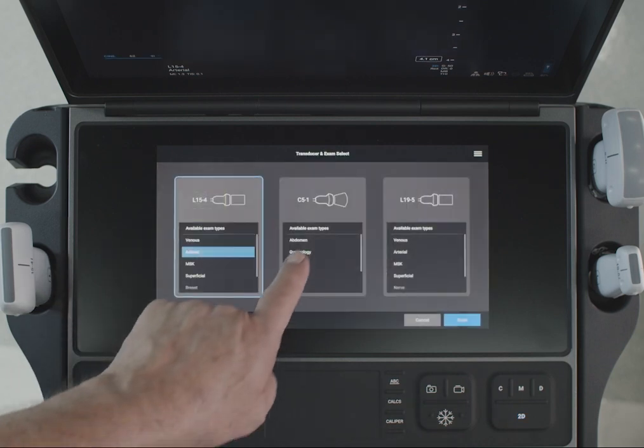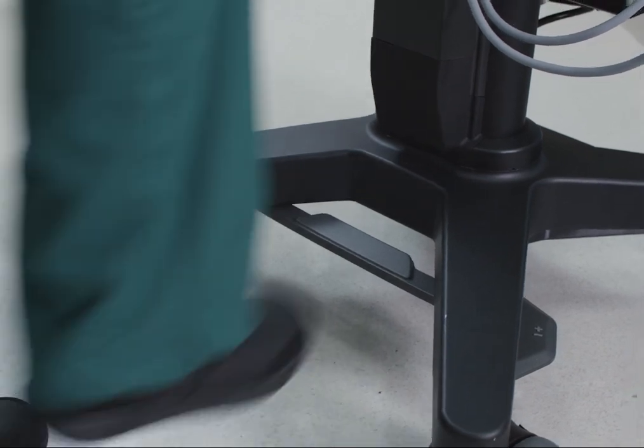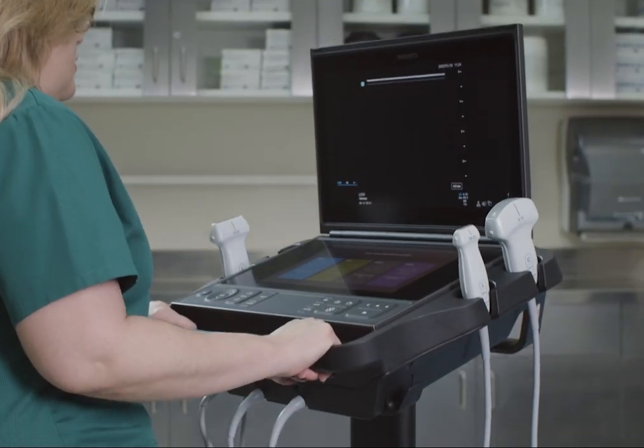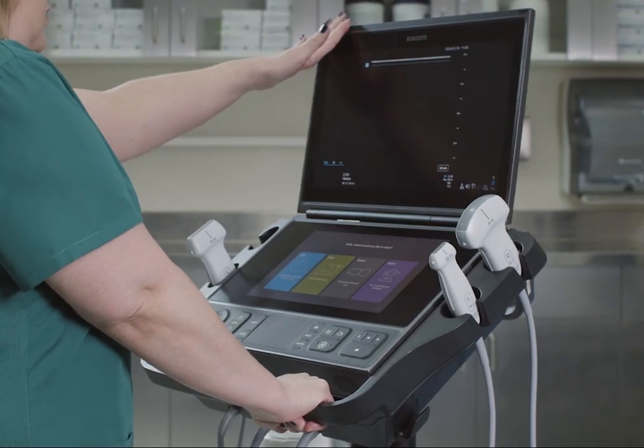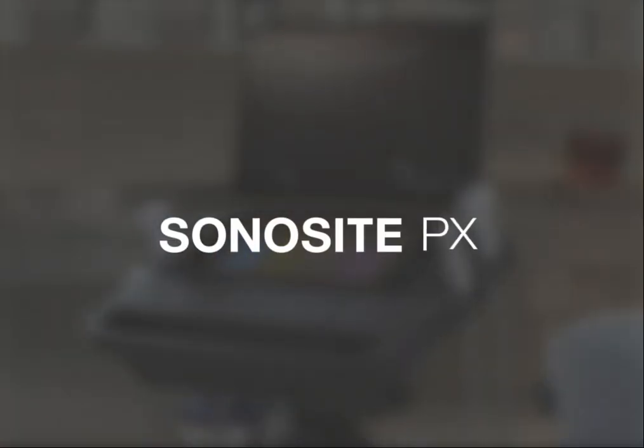Switching exam types is just as simple. The adjustable stand allows you to customize the system's height and angle. Now it's time for you to explore the Sonocyte PX on your own.